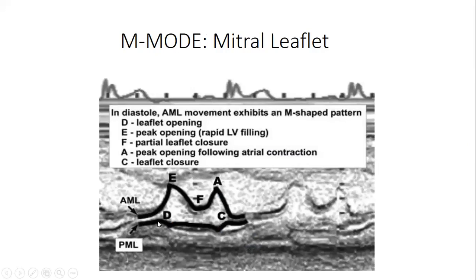And then this is the posterior mitral valve. And this is what goes on here. Any questions that we can stretch this?